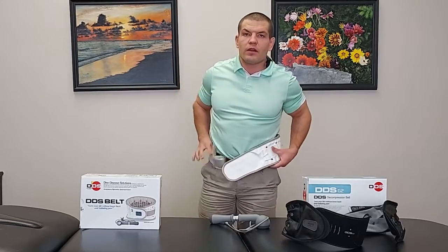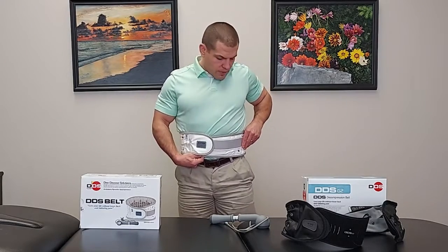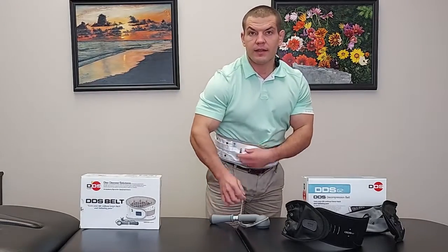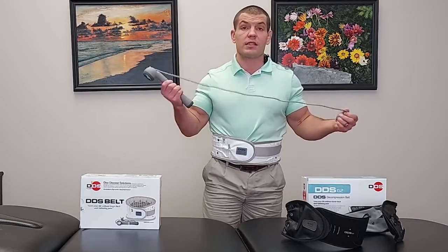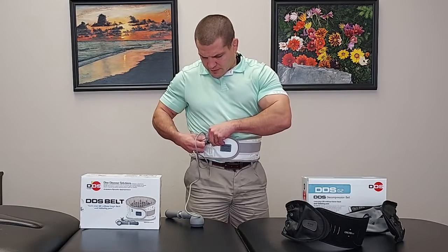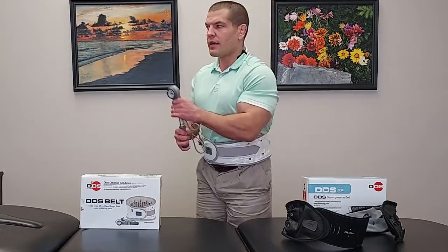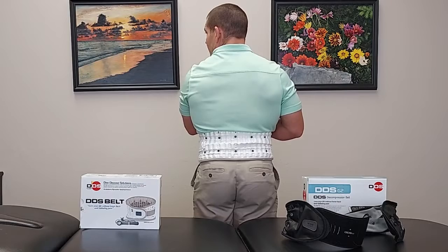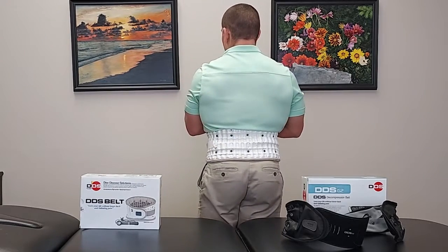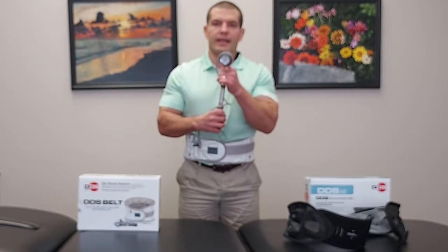Both braces are made to unload your spine. You put them on right underneath your rib cage and right above the pelvis. You strap it on, tighten the Velcro strap, and there's a little valve. The pump is interchangeable — you can use the same pump on either brace. Make sure the valve is tightened, clip the pump on, then pump it up and you can see the brace expands vertically. This is the DDS-300.